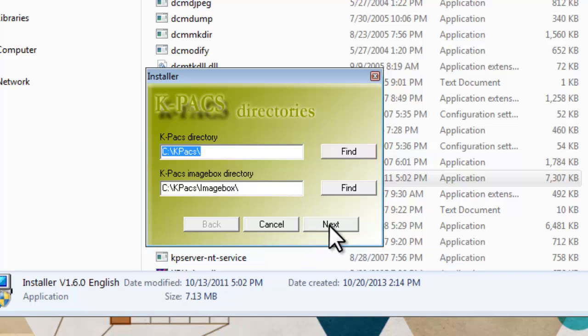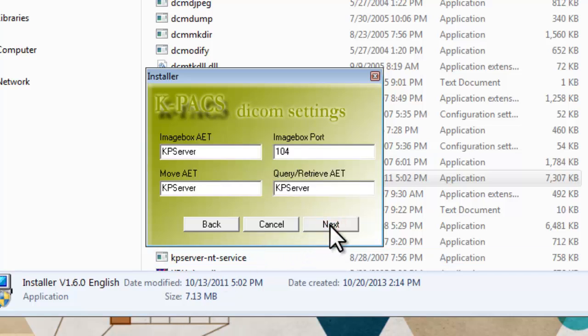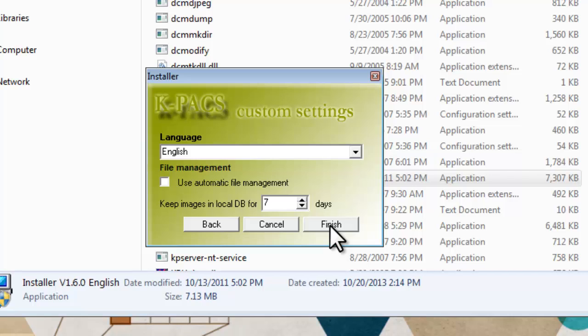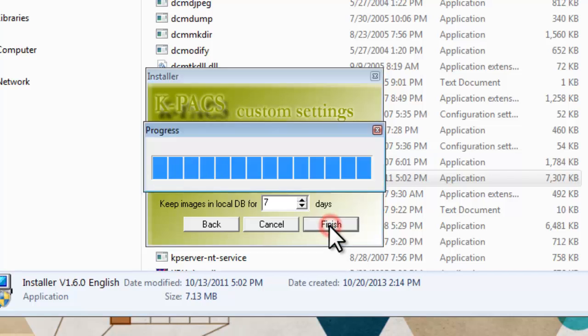You hit Next. Project Directories. Next again. Next. And you're finished.